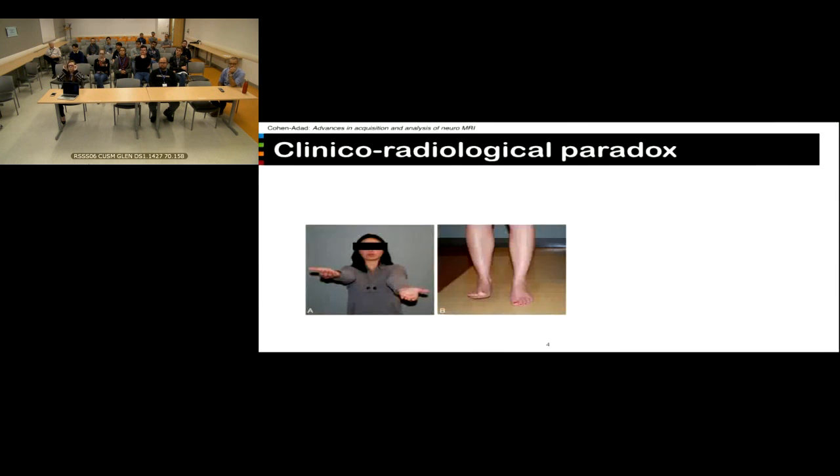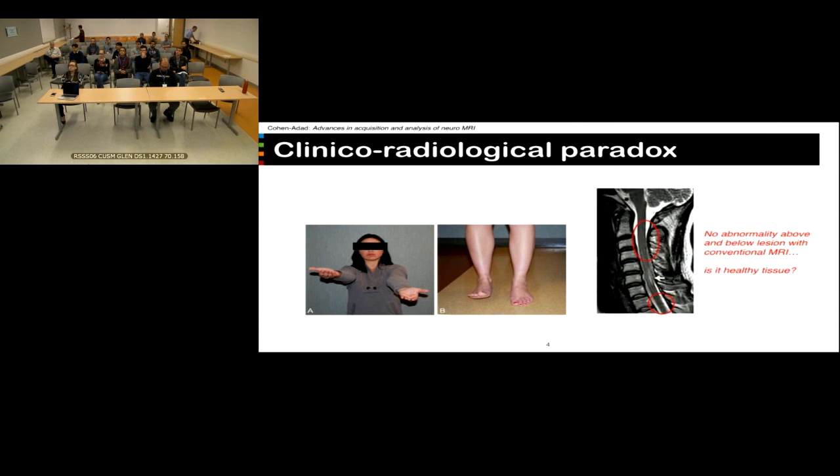So first of all, the context that I always show is that of a patient who was referred to a neurologist at MGH in Boston, who I was working with. It's a patient who unfortunately had an intramedullary lesion that was produced by clinical malpractice. Basically, they injected some corticosteroids inside the medulla where it was supposed to be around it, and as a result, this patient had a very focal spinal cord injury that we can see on the T2 weighted image.